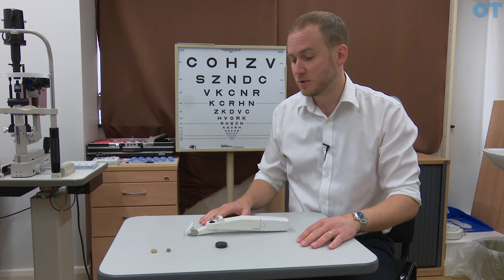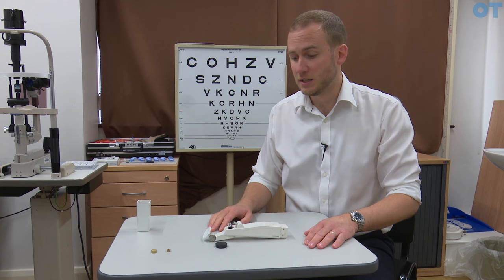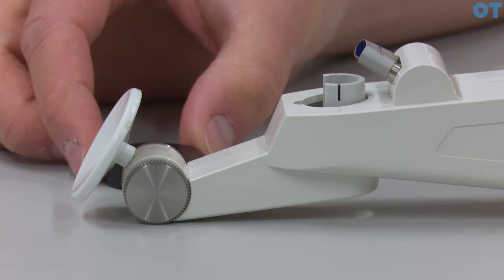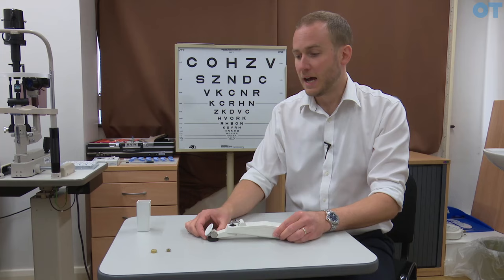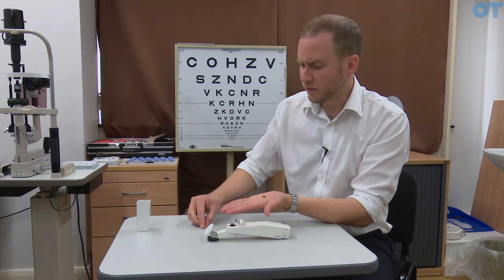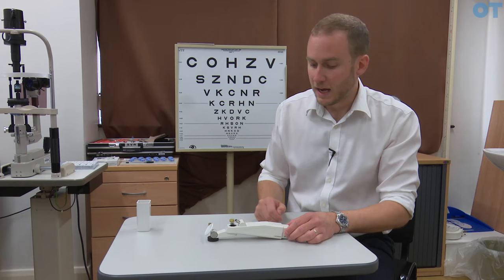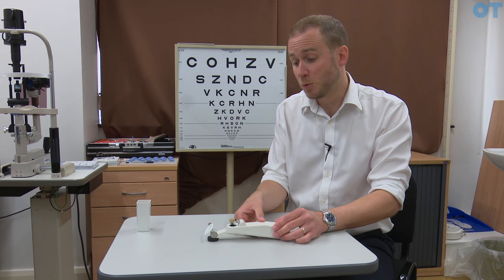As with any instrument it's important that we calibrate. To do that we need to firstly take off the battery pack, use a flat surface and place the instrument on its back. We also need to make sure we have the probe in situ. With every Perkins tonometer there's a black disc — this is placed under the head of the instrument. We then use two weights which are placed on the tip of the probe. These two weights are five grams and two grams. For now I will only place the five gram weight onto the probe.